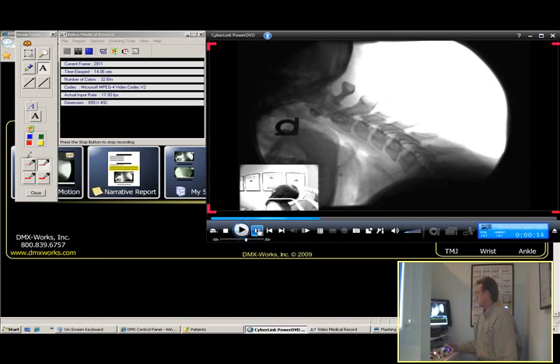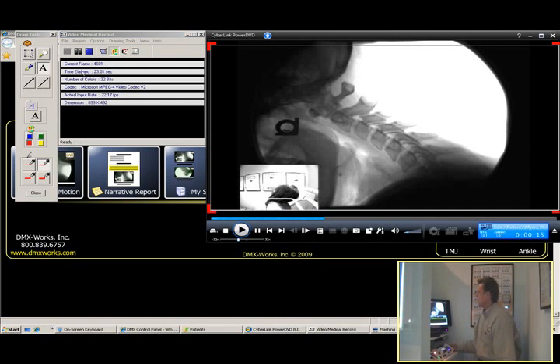So what's going to happen — we're going to see Rachel here in the bottom left-hand corner. She's going to bring her chin to her chest and I'm going to freeze or pause that image. So that's a static x-ray right there. I'm going to come up here to my drawing tools, the palette, and I'm going to count down. Using my keyboard, I'm going to put the numbers: the first, the second, the third vertebrae, the fourth cervical vertebrae, the fifth, the sixth, and the seventh. That way we know which vertebrae we're looking at.